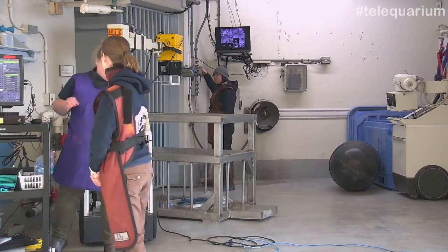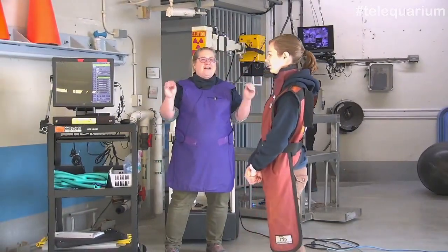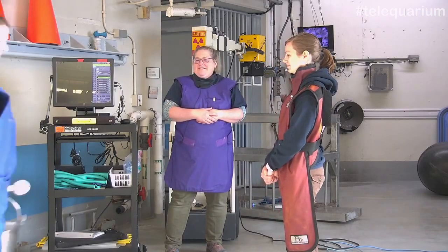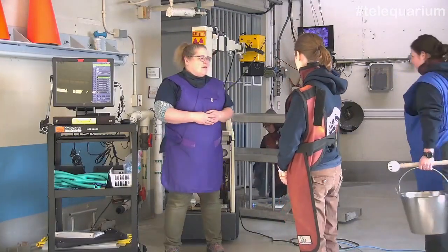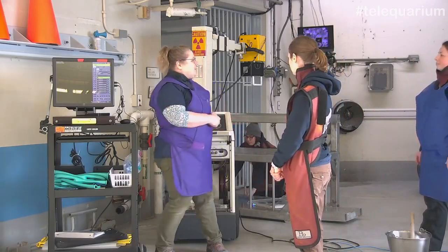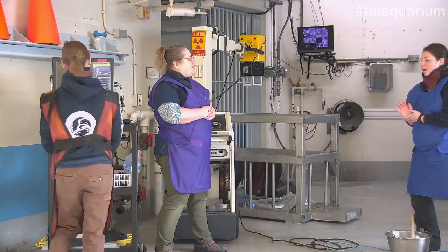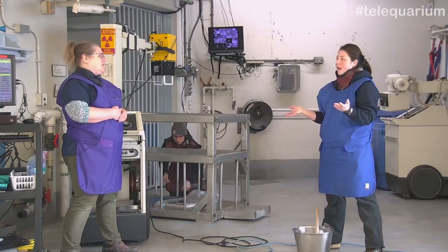So believe it or not, when we did this last week as a practice run, she was rock solid. But this is what happens, you know, sometimes you feel it, sometimes you don't. And that's perfectly normal. We're perfectly cool working with that. So I think we're going to readjust the x-ray again. And Shelby, what do you think? Do we want to try again or do we want to give it a break and maybe try later on today? I'd like to maybe try one more time just for positivity.